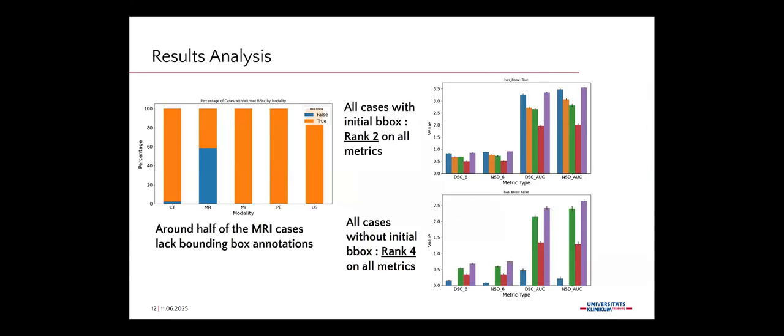And here's the same results again. What we found is that our model in the end really struggled on the validation set. Now we don't know the distribution of the training set, how much the problem is there, but on the validation set, we saw that it really struggles on the cases without bounding box. And unfortunately, we also submitted the wrong checkpoint. We had a checkpoint where the difference was not as drastic, where it was performing a bit better on the bounding box. So it seems that in our training, it's very unstable on those cases without bounding box. What we did was simulate a bounding box in the center of the image, since that seemed to work, but it seems that's not a good way in general for these cases.